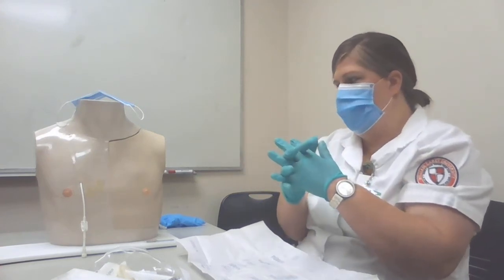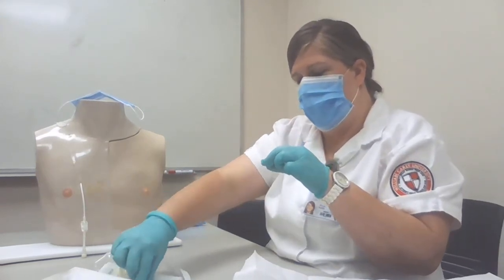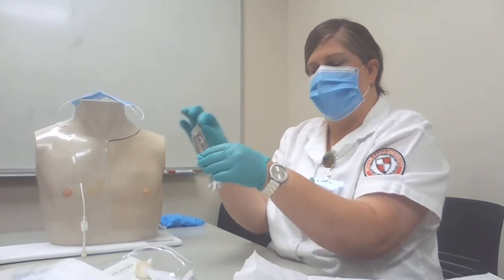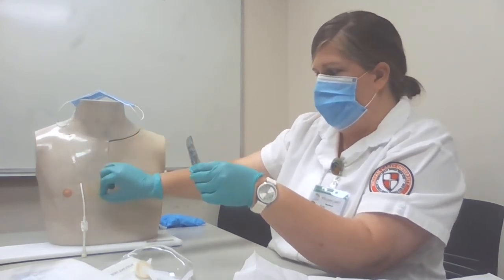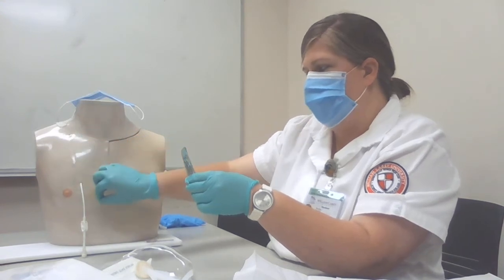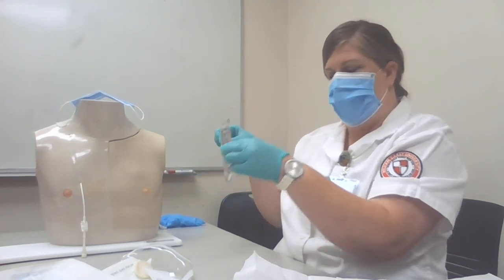Alright, next I would get my alcohol swab, and for demonstration purposes I'm not going to open it, but I would take one and swab it down, discard it into the biohazard bag, and take another one and swab toward the side and place it up in the biohazard bag.